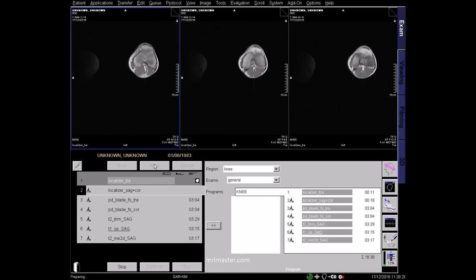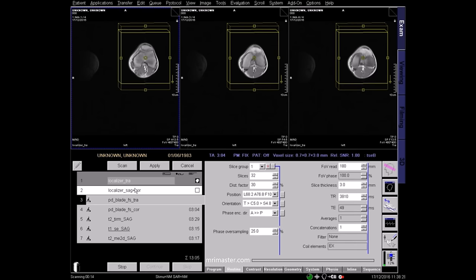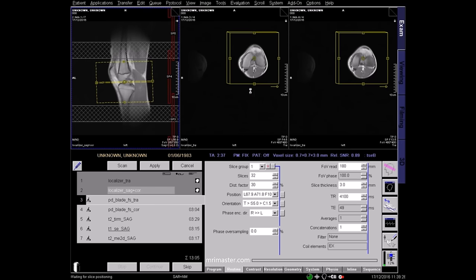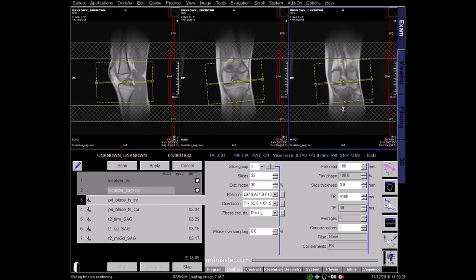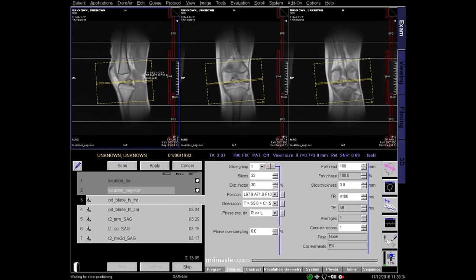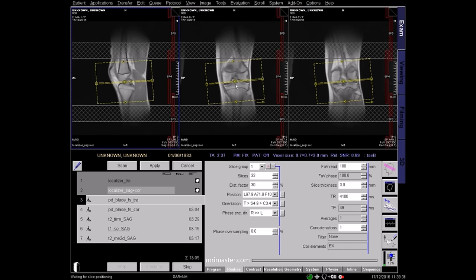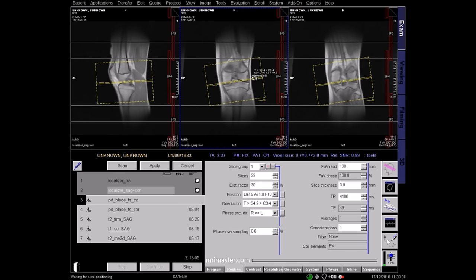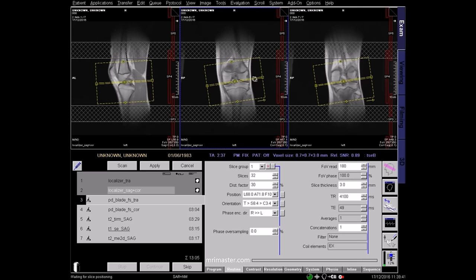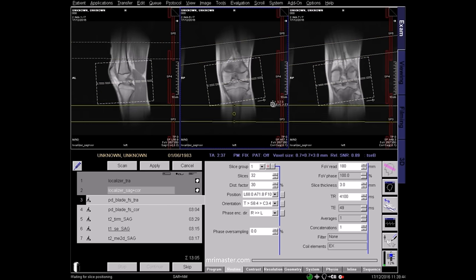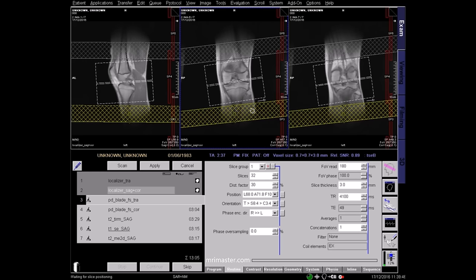In this protocol the first diagnostic sequence is a proton density, or PD, fat saturated axial. On the sagittal localiser, angle the positioning box perpendicular to the line through the long axis of the femur and tibia. Make sure the block covers the area from above the patella to the tibial tuberosity. On the coronal view, angle the slices parallel to the tibial plateau. Using saturation bands above and below the axial block will further reduce arterial pulsation artefacts.